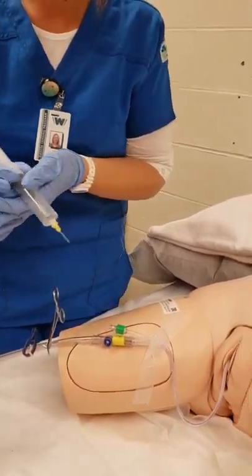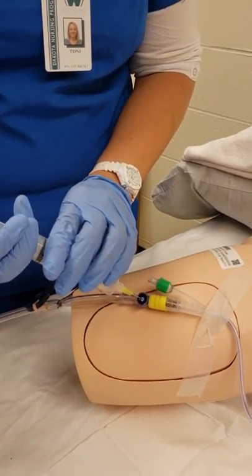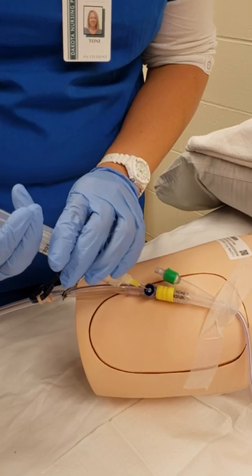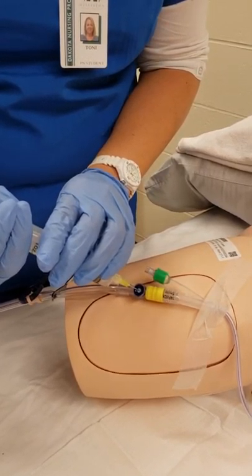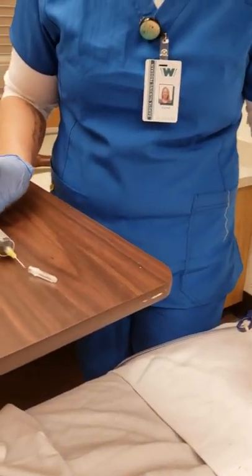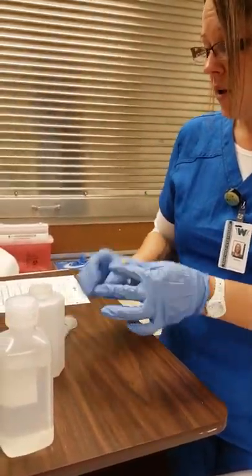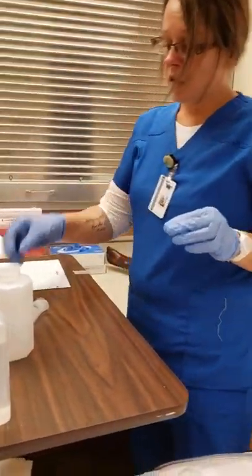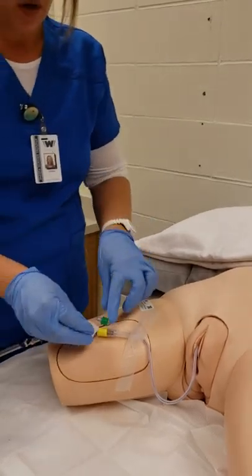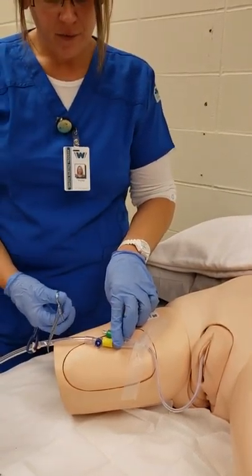I irrigate by instilling the 30 mL very slowly just to make sure no cramping or problems occur. Once the 30 mL are done, I pull back out and use the scoop method for my needle, grabbing by the sides. I pull the needle off directly and dispose of it immediately in the sharps container. Then I cleanse the port again for 30 seconds afterward.